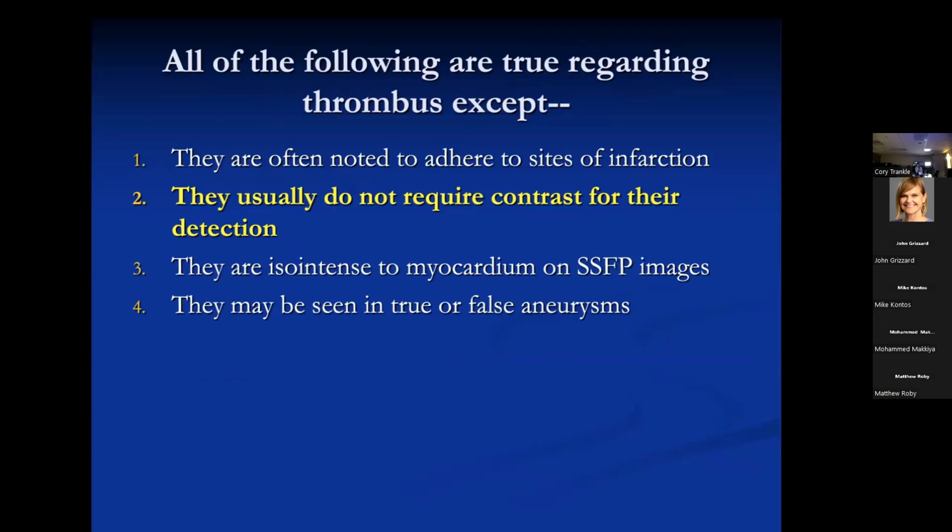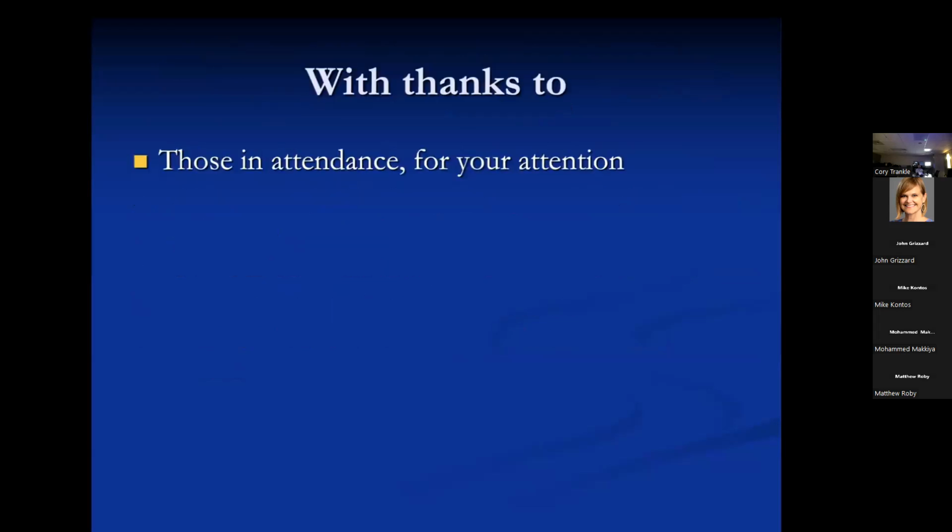Regarding thrombus, you really do. Do they not require contrast? This is a false statement. They do require contrast. Okay, and that's it.